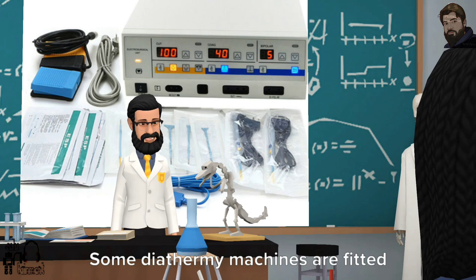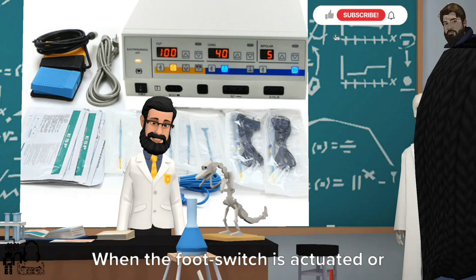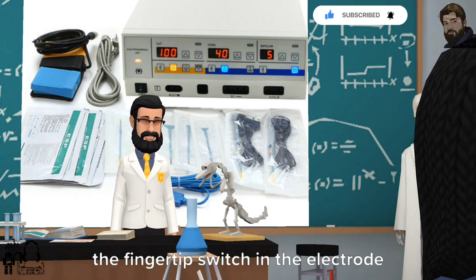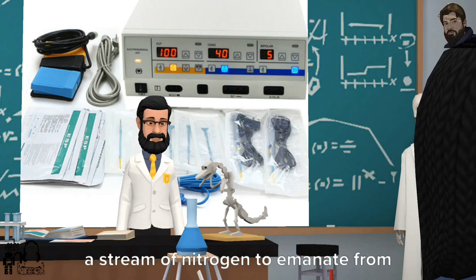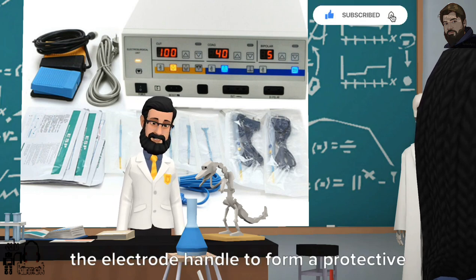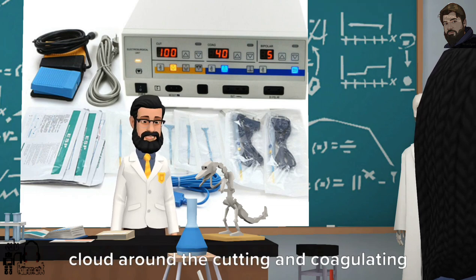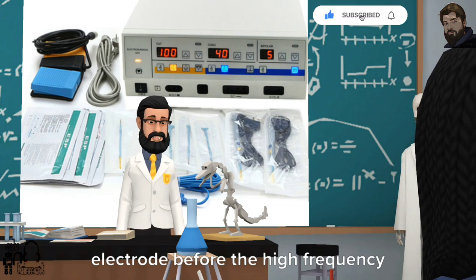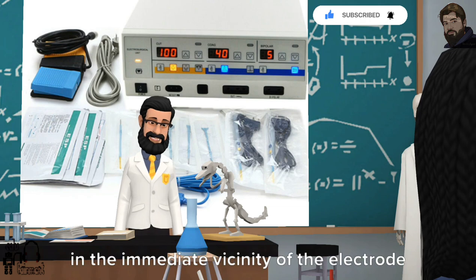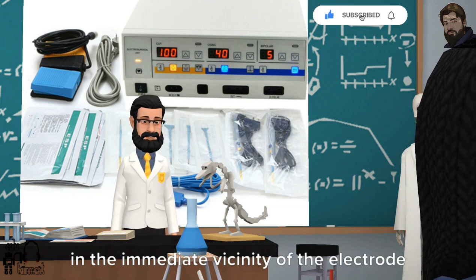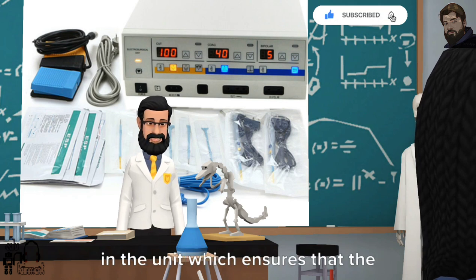The foot switches of the electrosurgical unit should be explosion-proof. Some diathermy machines are fitted with automatic explosion protection devices. When the foot switch is actuated or the fingertip switch in the electrode handle is operated, this device causes a stream of nitrogen to emanate from the electrode handle to form a protective cloud around the cutting and coagulating electrode before the high-frequency generator is switched on. Hence the explosive gas mixtures in the immediate vicinity of the electrode cannot ignite.